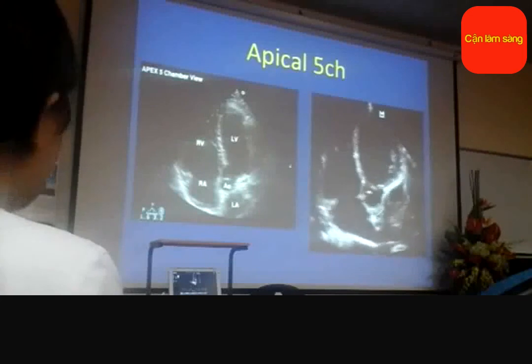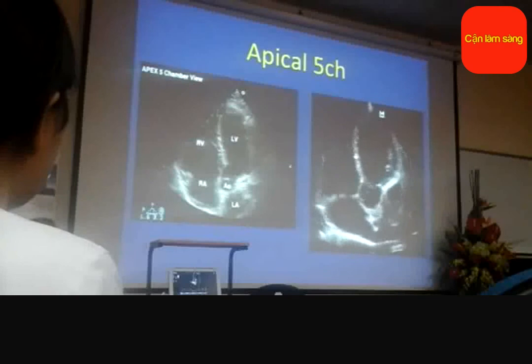A good view for looking for aortic velocities and aortic insufficiency.